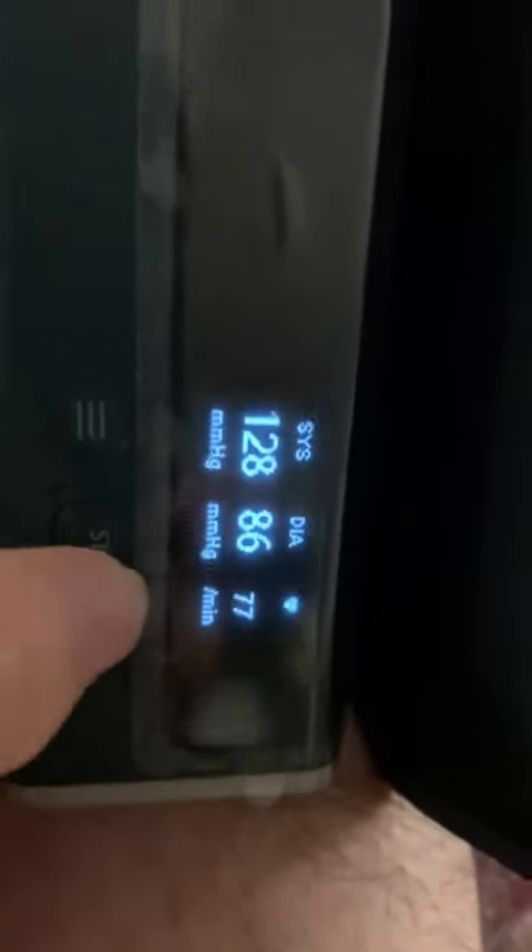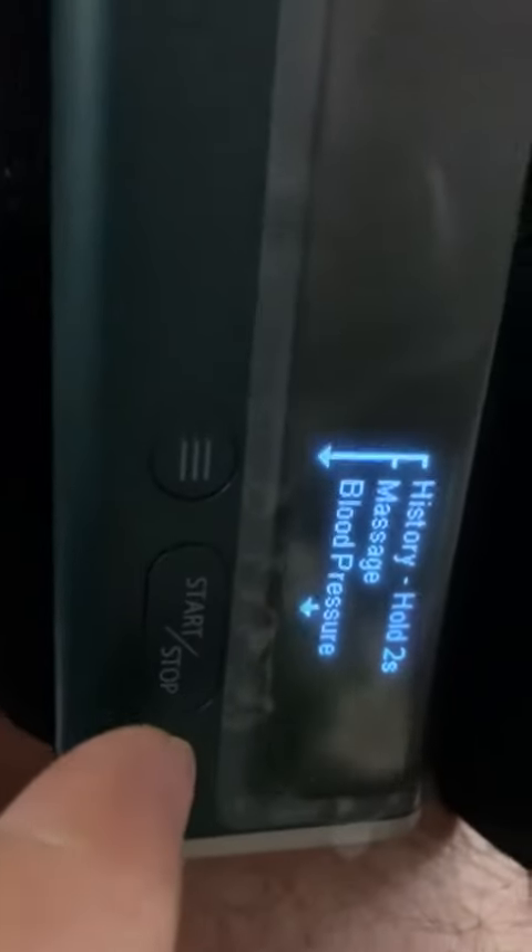It has other functions too. You can view the history or use the massage function. I mainly use it for the blood pressure monitor because I have a TENS machine, but for someone who doesn't have a TENS machine, it has that functionality too.